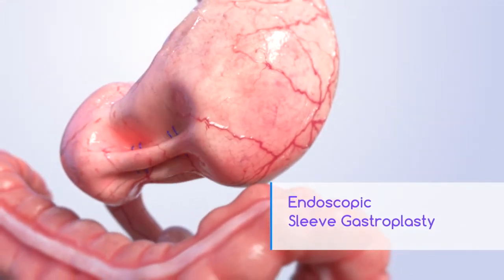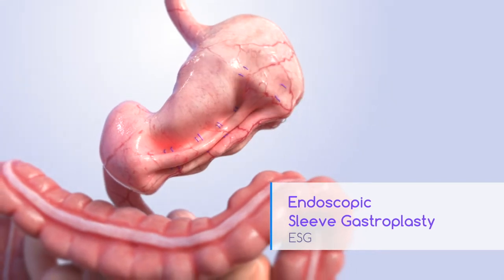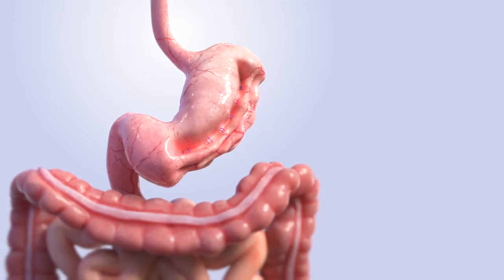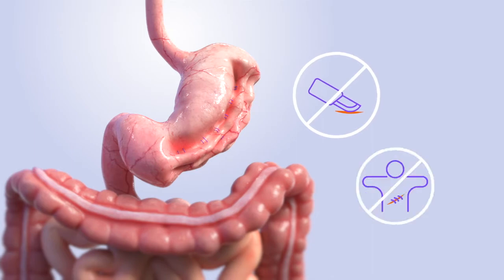Endoscopic Sleeve Gastroplasty, or ESG, is a weight loss procedure that reduces the size of your stomach so you eat less and feel full faster. It is performed by a specially trained doctor endoscopically, which means no incisions, no scars.